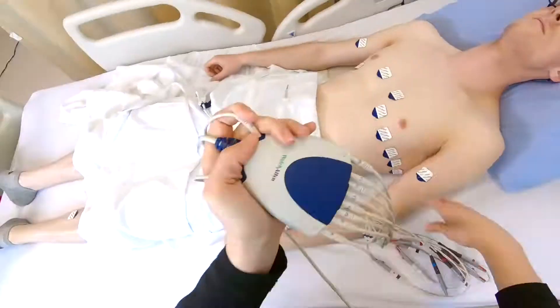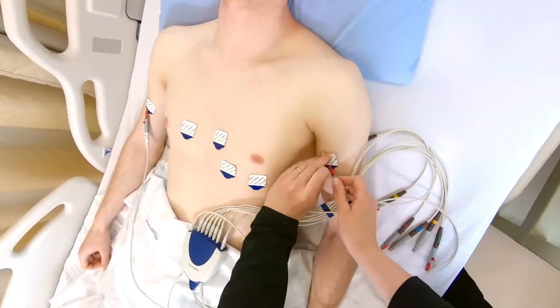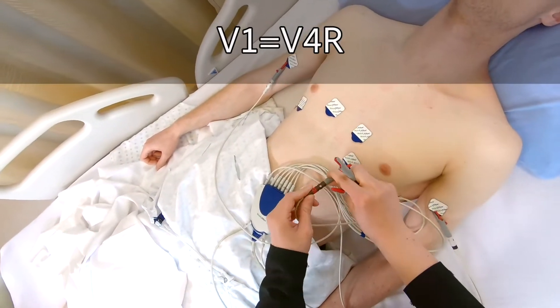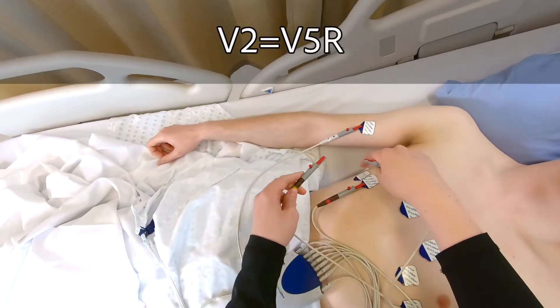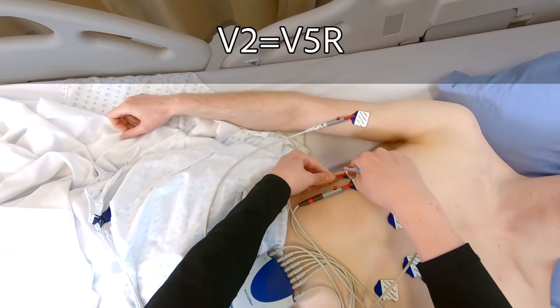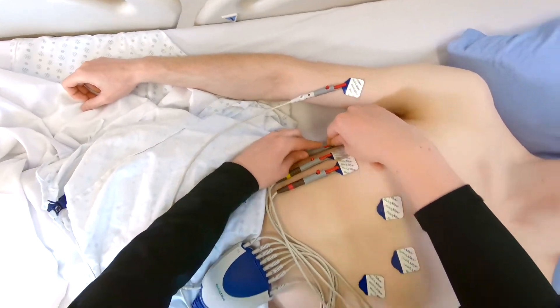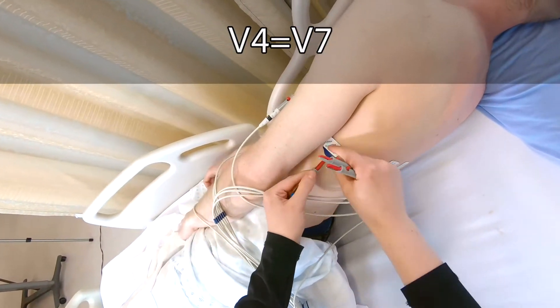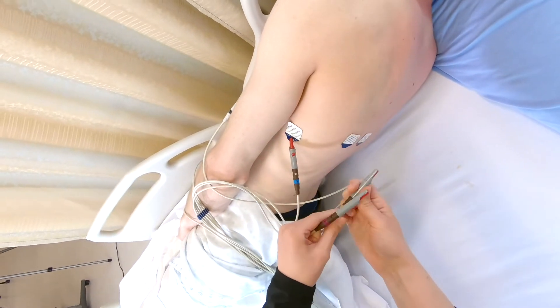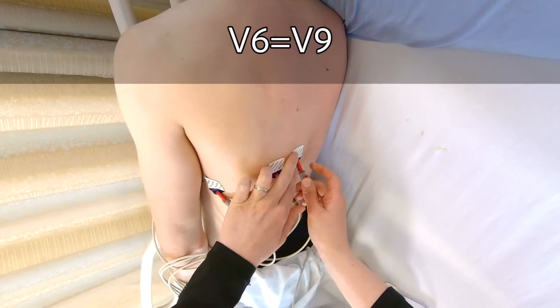Next, place the leads. Limb leads remain the same. V1 becomes V4R, V2 becomes V5R, V3 becomes V6R, V4 becomes V7, V5 becomes V8, and V6 becomes V9. Place the patient in a supine position and capture the ECG.